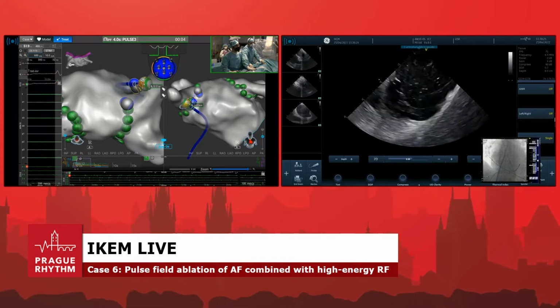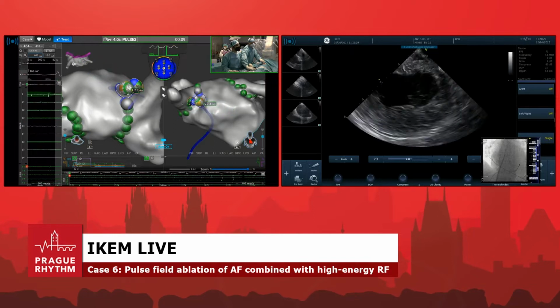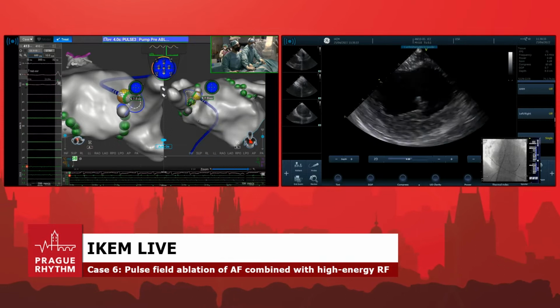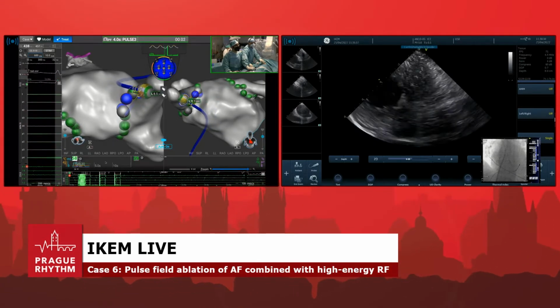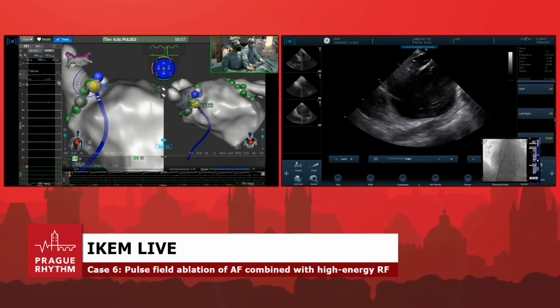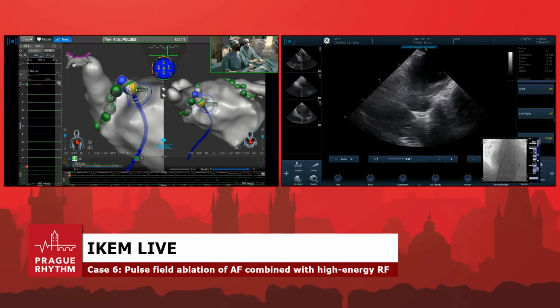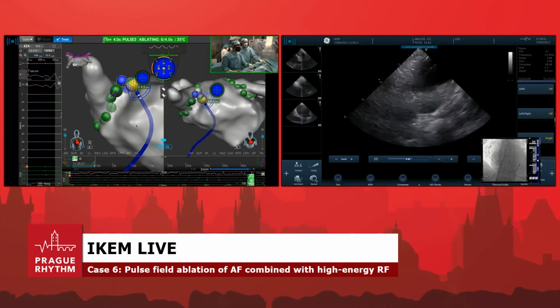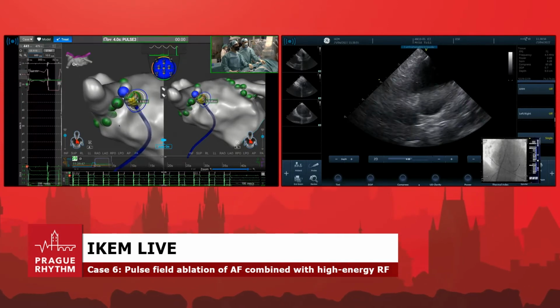This is obviously a little more time consuming than a single shot, but on the other hand, it's very versatile. You can do any line, you can do mapping, you can see the anatomy. Peter, can you show the catheter again? It's a different system. This one is more universal, which allows you to do practically any ablation in the atrium.